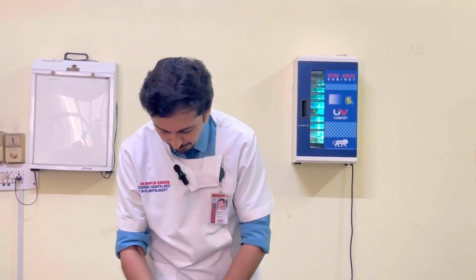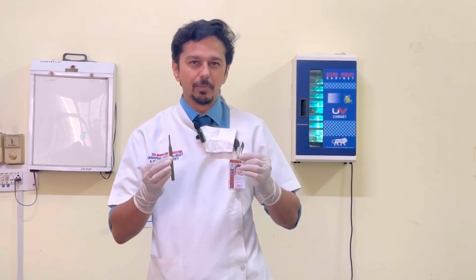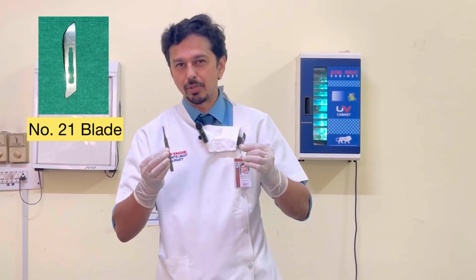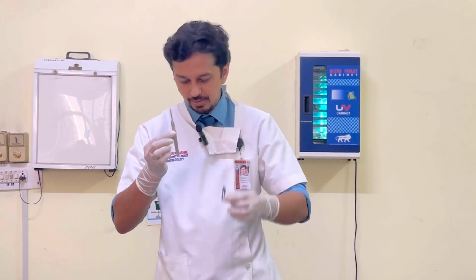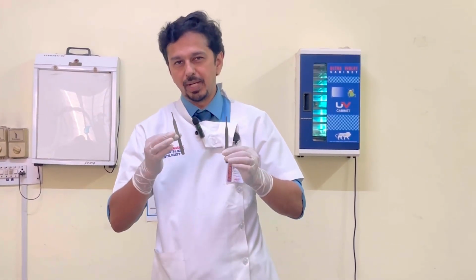On the other hand, number 4 BP handle attaches blades which are much larger, blades number 20 to 24, the ones which are used in prosthetics for trimming, border molding, etc. So the first thing that we have to do is identify our BP handle.